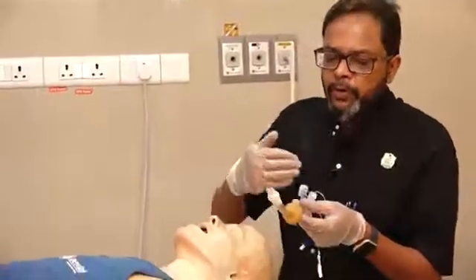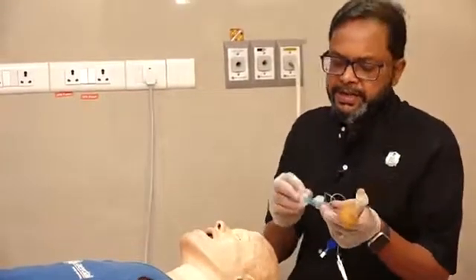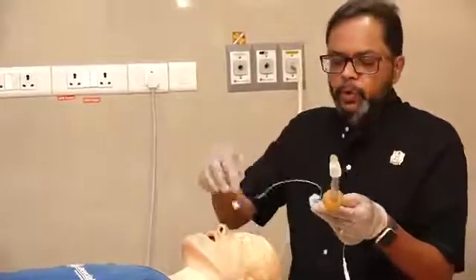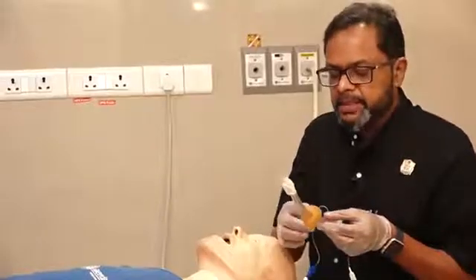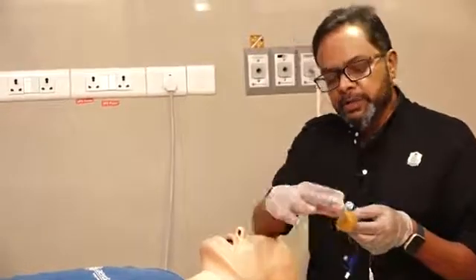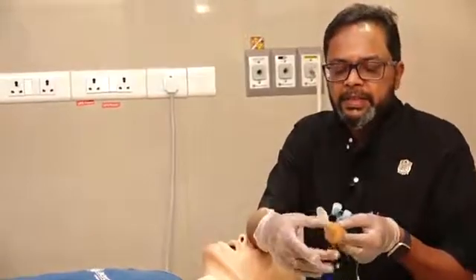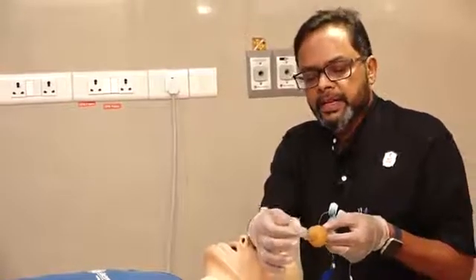Following tube number one, you can see there is a universal connector, then a transparent portion, then a blue balloon which is the pilot balloon, and a mark — this mark should be at the incisor level during final insertion. Going down, the tube has two cuffs: the yellow one is called the pharyngeal cuff, and the other is called the esophageal or tracheal cuff.